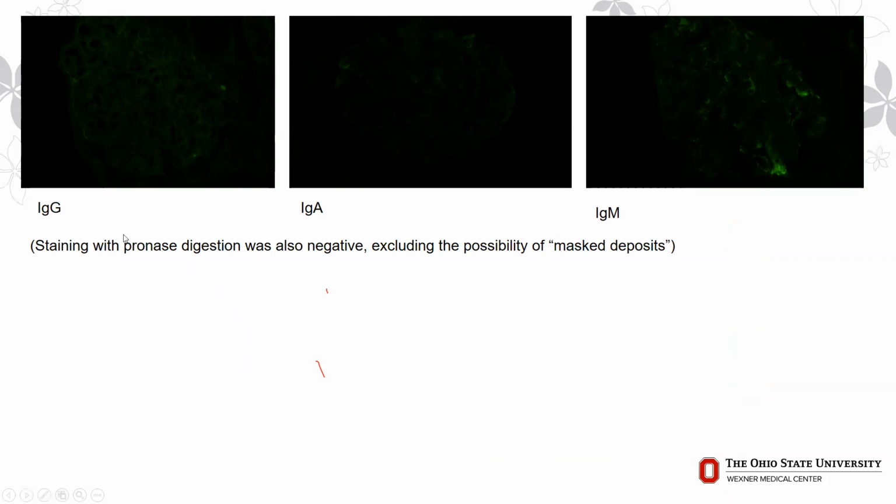We did try staining with protease digestion to make sure these IgG deposits were not now masked, to unmask the deposits, but it made no difference. We did not see any staining even after that.